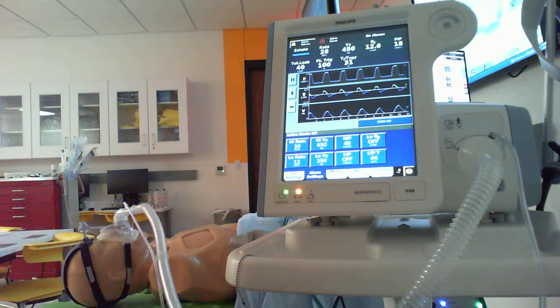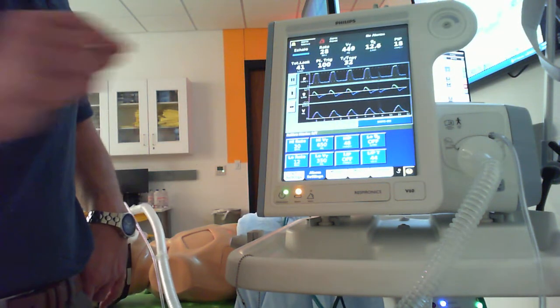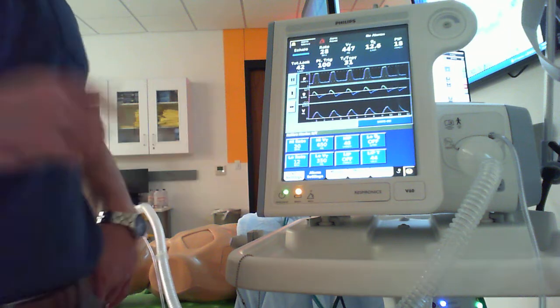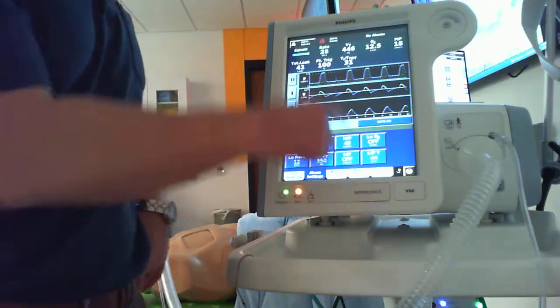High and low pressure, the V60 does this a lot better than the old Vision did, and it makes it much more explicit. The pressure high and low is only referring to our inspiratory pressure, and it's going to let us know if there's a leak that the machine cannot overcome. It is going to alarm these settings, okay?